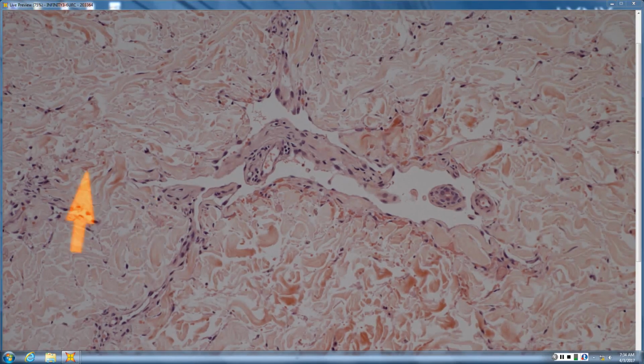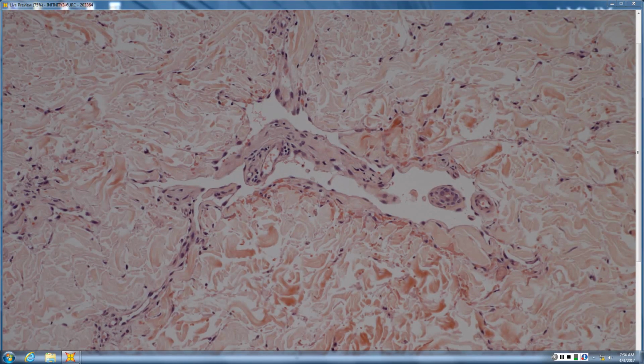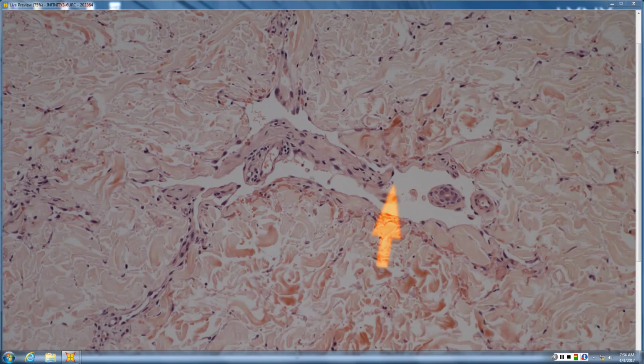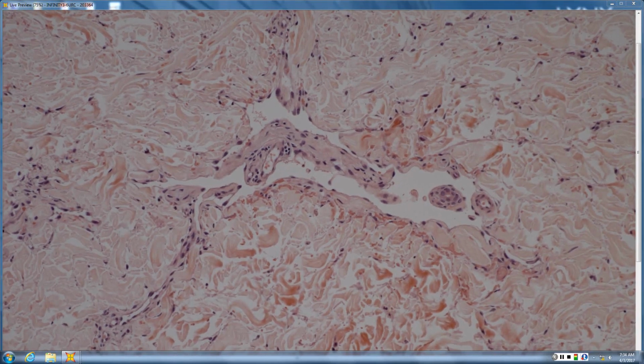And what would you call it if you had something jutting out into, say, an ocean like that, and you were able to stroll out onto it and watch the sunset? You might call that a promontory that you're strolling out onto. So is this early patch KS? It looks like with these dilated, irregular staghorn vessels and promontory sign and vascular wrapping, it looks for all the world like patch KS.